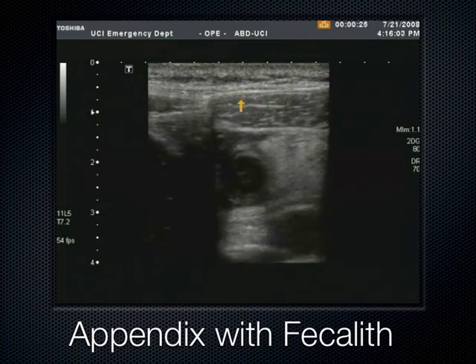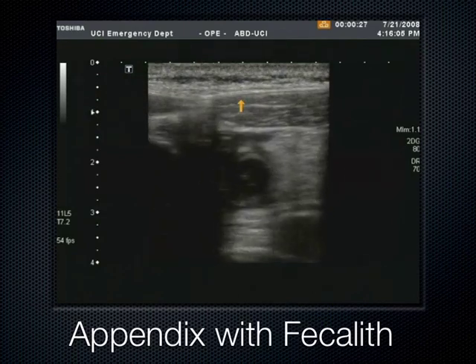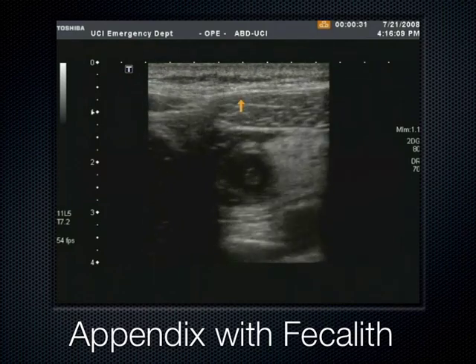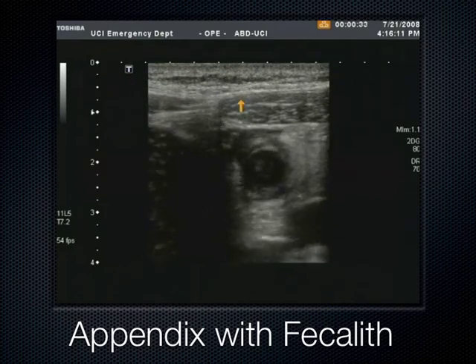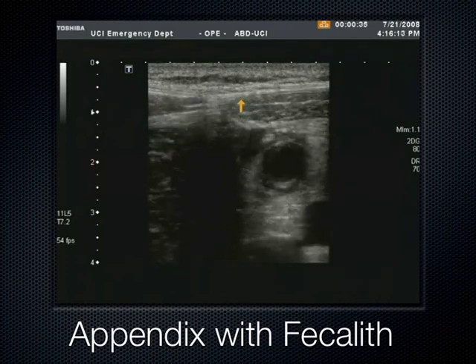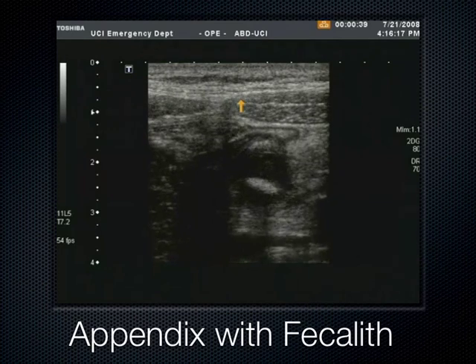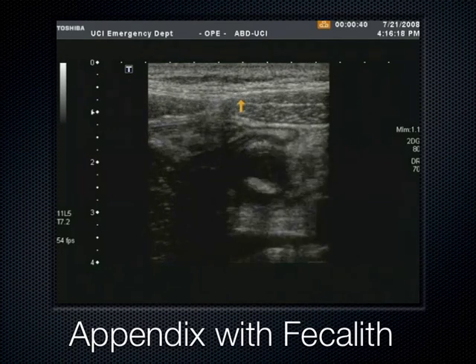Here is one last example of another patient with appendicitis. We can see here, this is the abdominal wall musculature. Again, this theme keeps coming up over and over again. Here's psoas somewhere down here, smushing this appendix between the two muscle structures. I think psoas is actually over here too. And this one's got a little fecalith right there. You see that? Which literally means poop stone. That's inside the appendix.